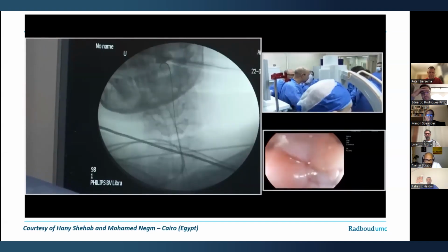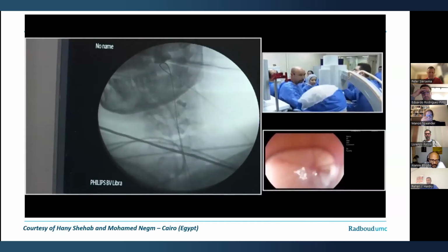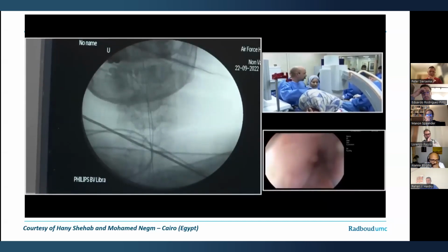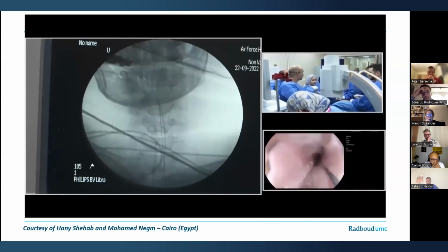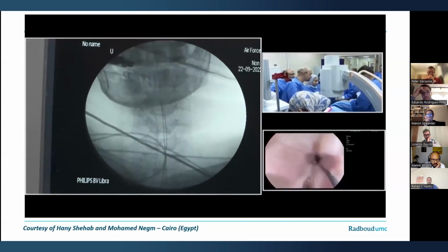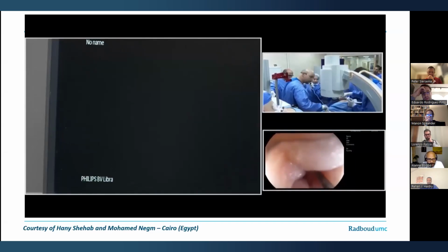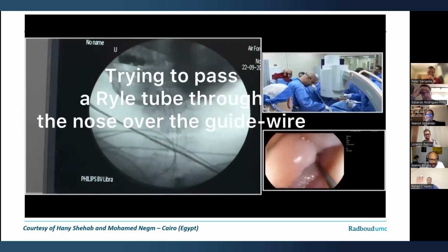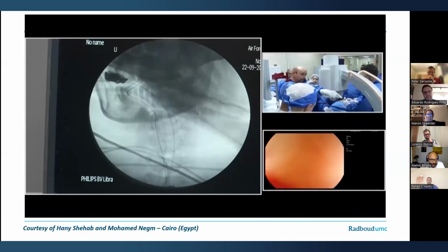That should be far enough. Feel it. Okay. So which size of NG tube would you recommend? The biggest you can put, 12 French or the bigger one? I would try this one. I'm not sure whether it will pass, but let's see. This is quite big. This is 12 French, the one I have. This is 20. Pay attention as well. You're going okay? So far, so good. Already inside. See, the tube is curling.